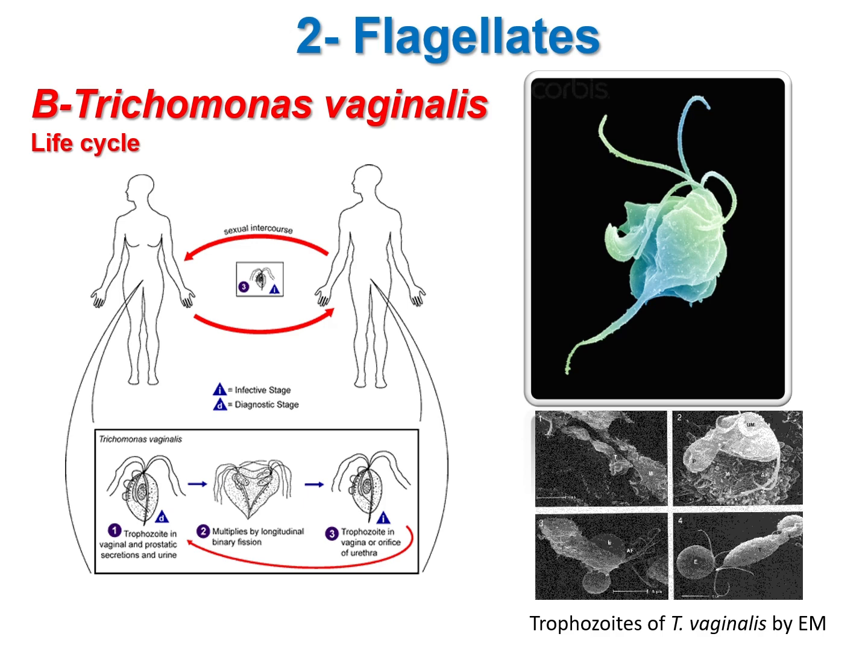It is very important to note that if we doubt this parasite, we should examine fresh preparations, because we have only the trophozoites that cannot be maintained for a long while under normal oxygen pressure. So we should go fast to examine whether the trophozoite stages are there in, for example, vaginal discharge.